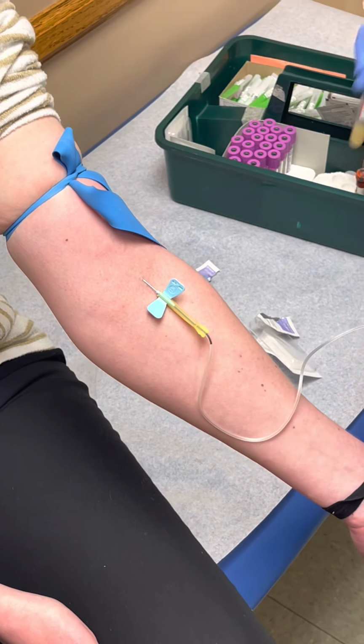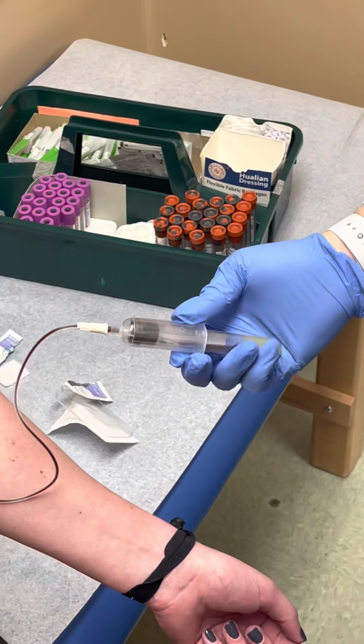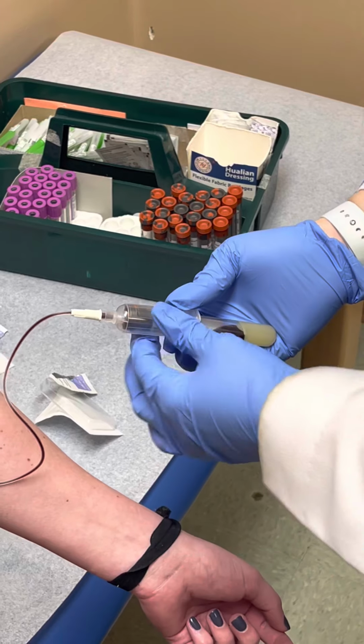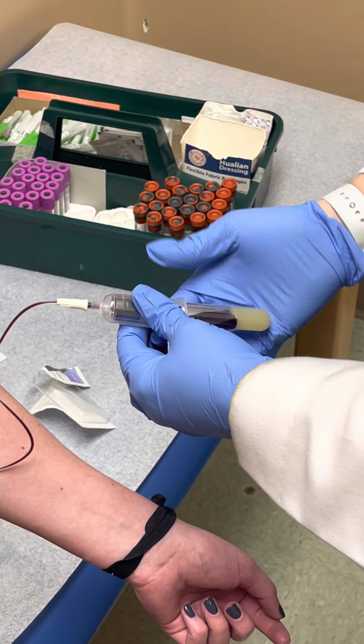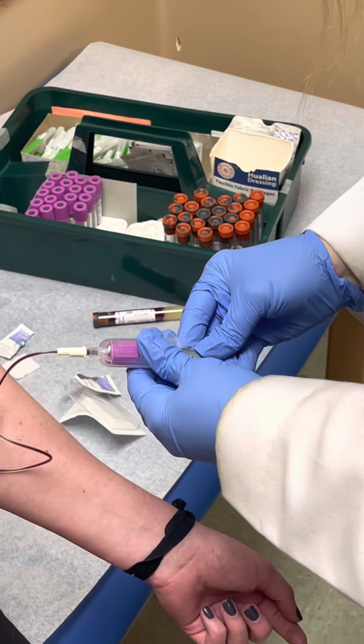Okay, so now we're going to apply our test tube. And again, there's a needle in there that's going to pierce it. This fills by negative pressure. So when we change out the test tubes, we fill it, and then we change it out, making sure that we don't disturb this.